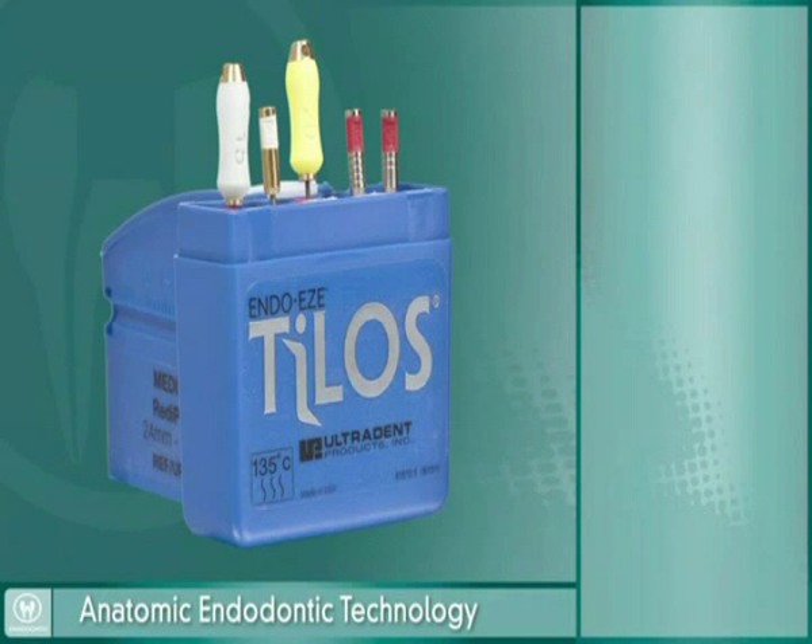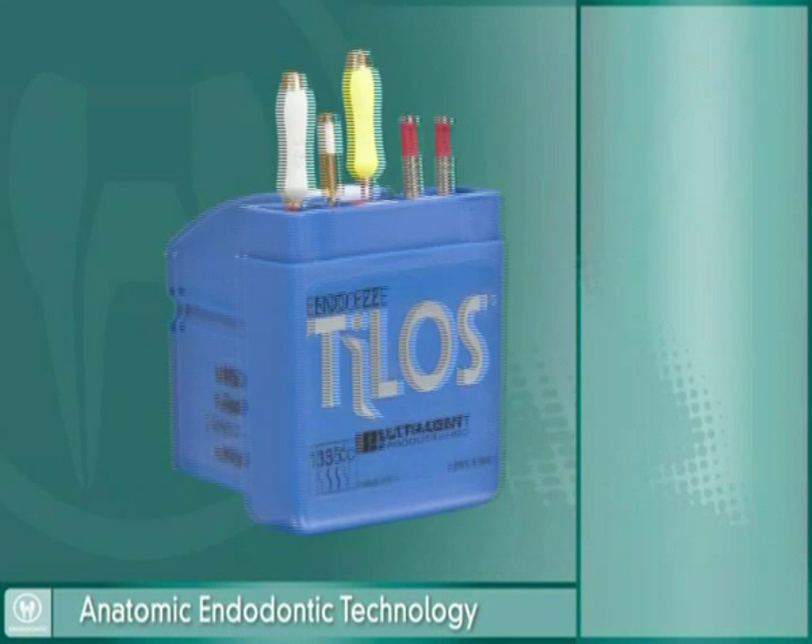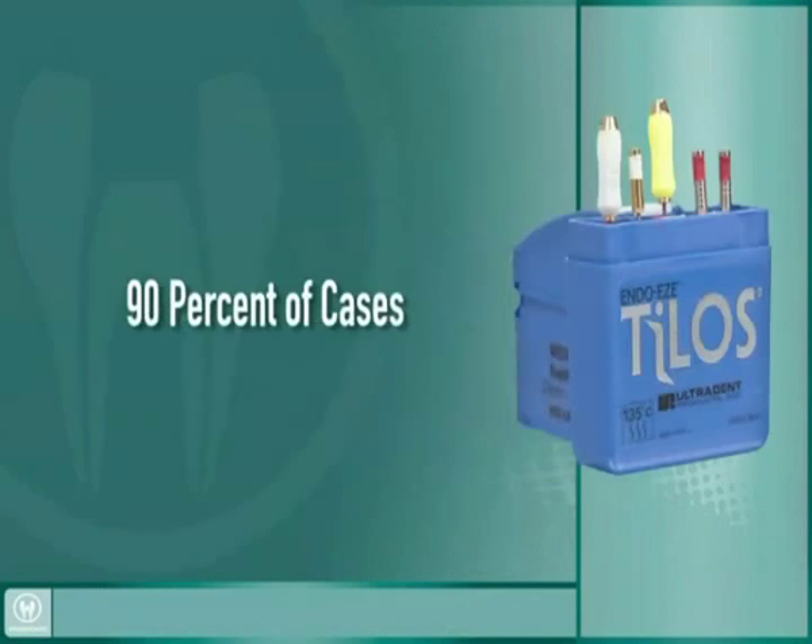EndoEase has developed the EndoEase Telos file system. The Telos ReadyPak contains everything you need to reach the apex and properly instrument 90% of your root canal cases.